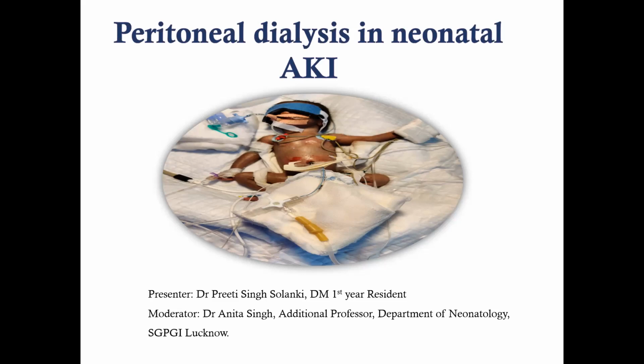So when to stop PD? Obviously, when the indication for which it was started is resolved. If you have done it for metabolic acidosis, then when your acidosis is corrected; if you have done it for oliguria, then when your oliguria has been corrected. The next simultaneous question is, how much time do we have to wait to remove the PD catheter? Preethi, would you like to answer this?